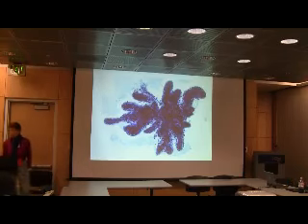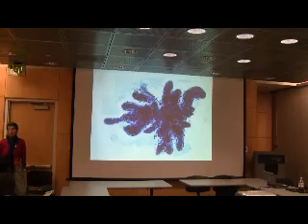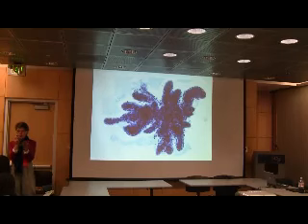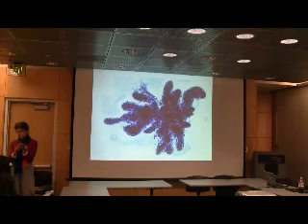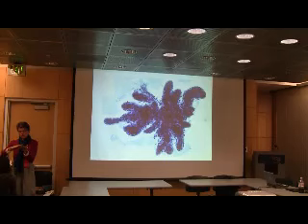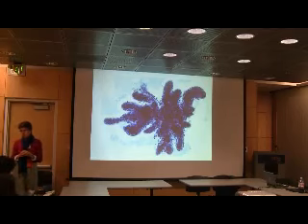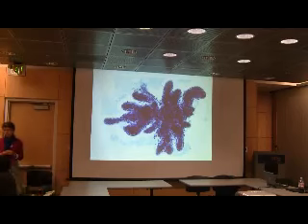So is that FNA tissue, when you're looking at it, do you put it on a slide? Okay. So you go in and you sample with a needle. You move the needle back and forth in the area so that you collect enough material to look at to make a diagnosis. It's then sitting inside the needle, and you push that onto a glass slide, and then use another glass slide to very gently spread it out on the slide. Either air dry it or fix it in alcohol, and then apply stains to it. And then this is what it looks like when you go in the microscope.